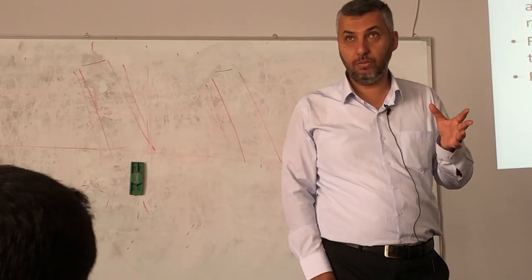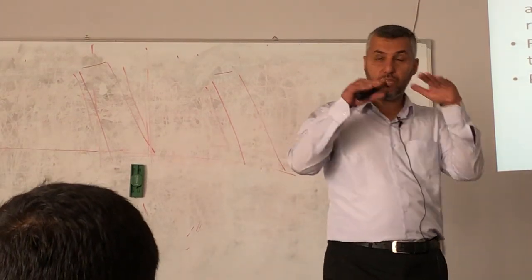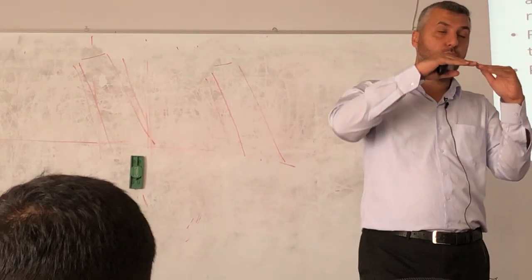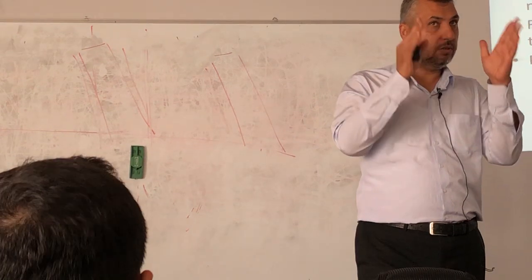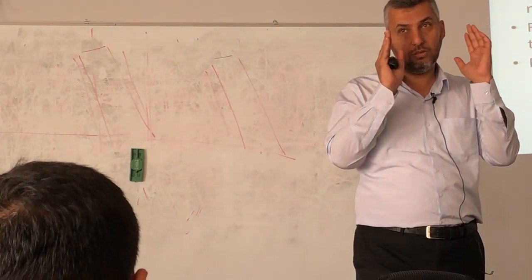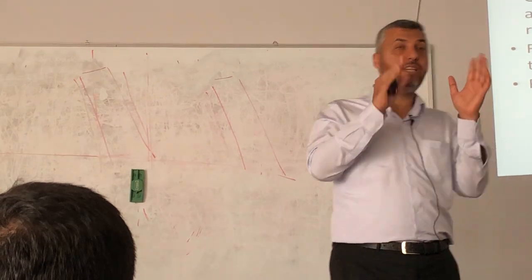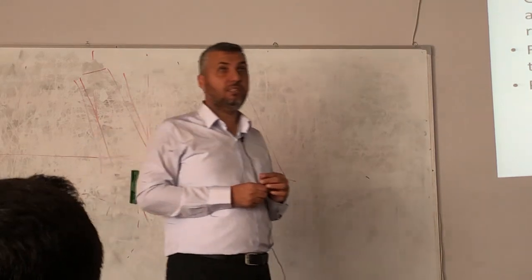Did you all see the surveyor? We did tilting for you. First of all we said 0 degree tilt. After that we tilt according to what? Not the patient. Until we get parallel surfaces, according to the parallelism.